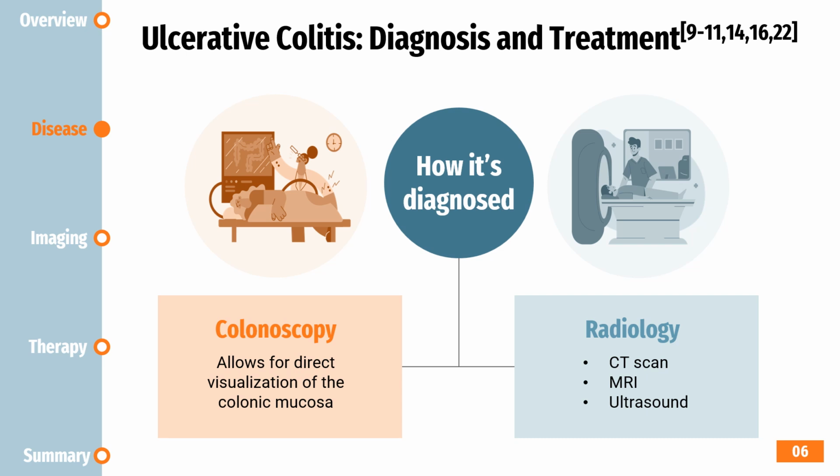Multiple biopsies confirm the diagnosis by identifying histopathological features like crypt abscesses and epithelial abnormalities while ruling out infections or malignancies. Endoscopy is also crucial for monitoring disease progression, treatment response, and colon cancer surveillance in long-standing cases, using advanced techniques like chromoendoscopy and endomicroscopy.